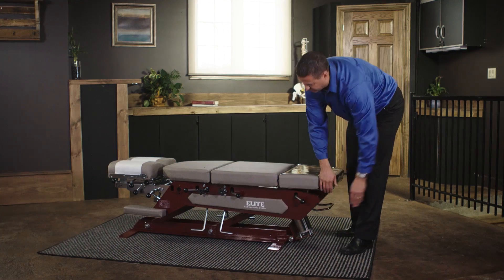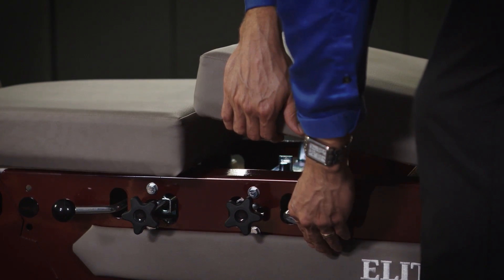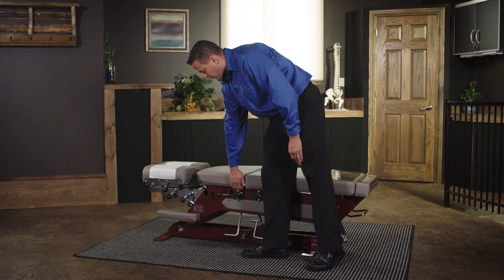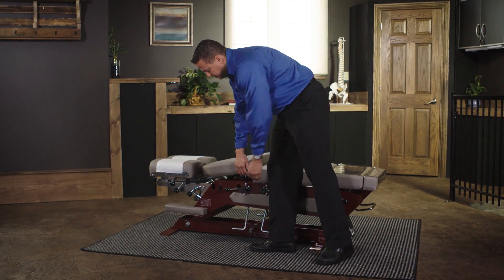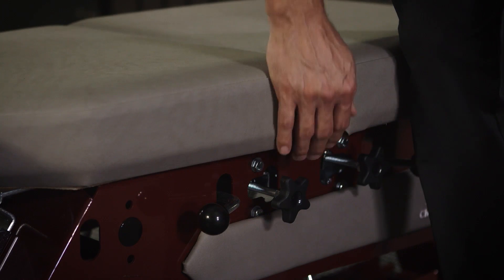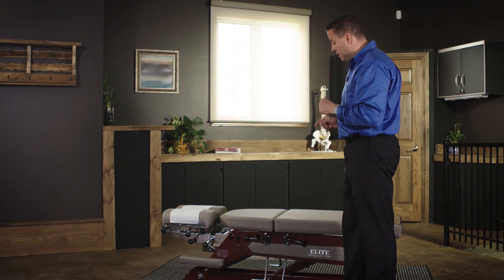The same thing happens in the lumbar space, and identically with the lower thoracic — lifting the cushion and the lever to bring it down. This table has three drops: the lower thoracic and the lumbar drops.